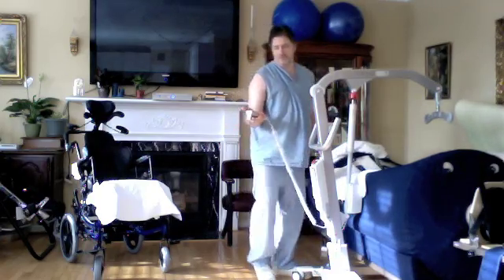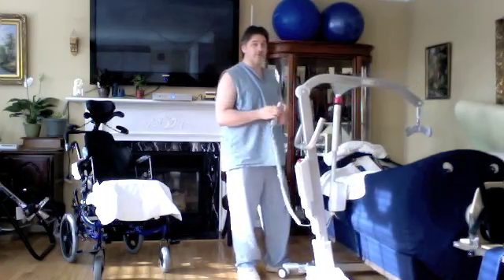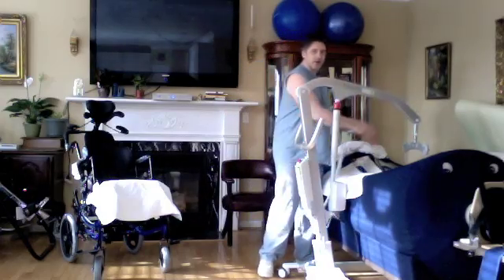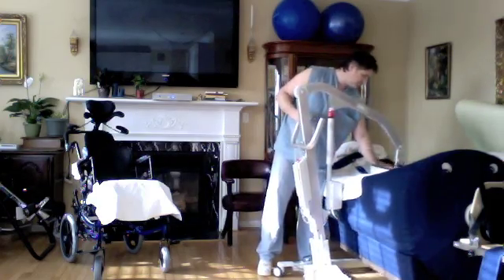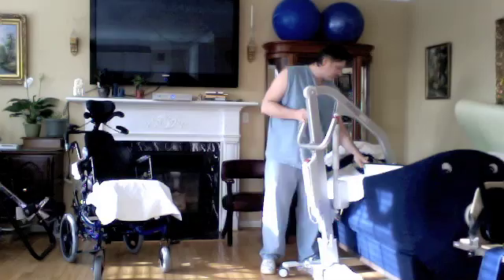And this lift we have is actually battery operated. It's nice. The one I had before, I had to pump it, go up and down. So it actually allows my hand to come in and work with him while keeping my hand on the control. So I just lower that down in there.